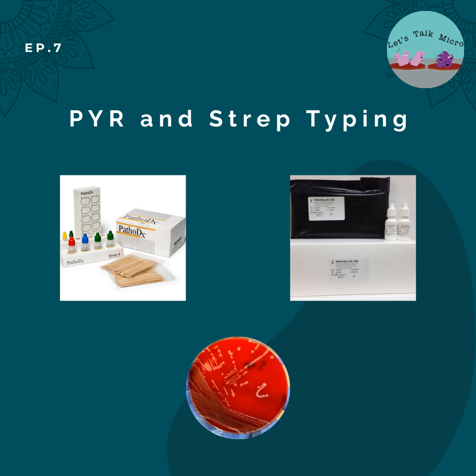So it was reported as Streptococcus agalactiae. Upon further investigation, it turned out that it was Enterococcus faecalis. So this is where you have to be careful. If you have beta hemolytic colonies on a PEA plate, depending on what the validation has been in your lab, maybe go ahead and perform a MALDI-TOF or another form of ID.